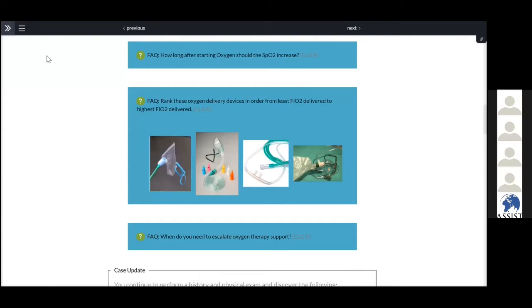give you a reading. And in some settings, they have a forehead probe, and that one takes a shorter time, about 23 seconds. But also, once someone has hypoxemia below 90, it will take about 100 seconds. So it's about 1 minute and 40 seconds to tell you if someone is hypoxemic. That's why we also need to know our patient, know that the reading may be delayed, and start acting immediately.